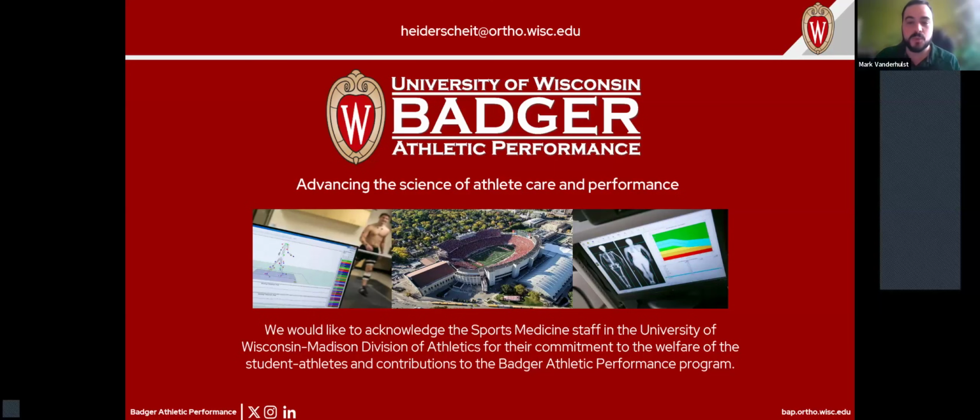Yep. We had a question here about the bone tracking application. Is that something that's added on the back end, or a live setting similar to PDI to give real-time information? Yeah, so at present, the bone tracking is added on the back end. It's not actually integrated into the current systems like PDI is, or other techniques that people are more familiar with using on their point of care ultrasound.